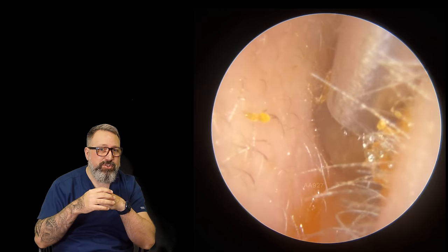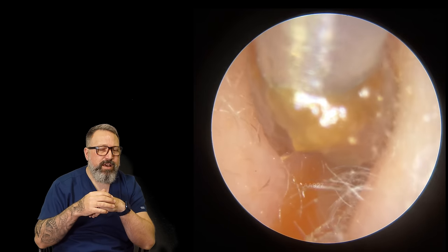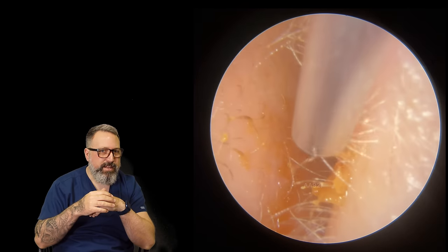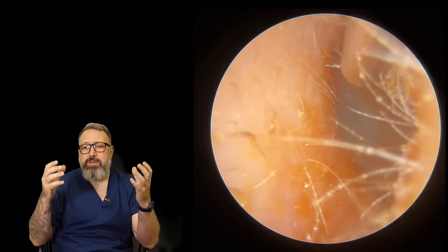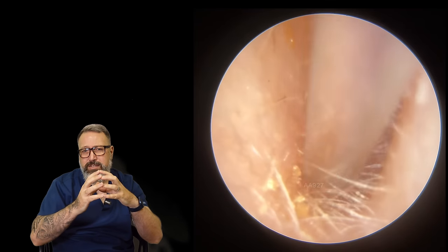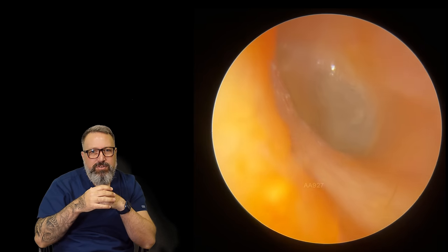Not an easy entrance to the canal - a little bit folded over, a little bit on the narrow side. There we go, out - this is starting to come. All the way out. And let's take a look beyond that. Fine end going on just to do a little bit of tidying up. Why do we use the fine end to tidy up? Just because it's a smaller tube - much easier to take little tiny bits off. If you've got a wider tube and you're trying to take smaller pieces off, it's really difficult. But looking nice and healthy, that ear canal. Eardrum looking good there.